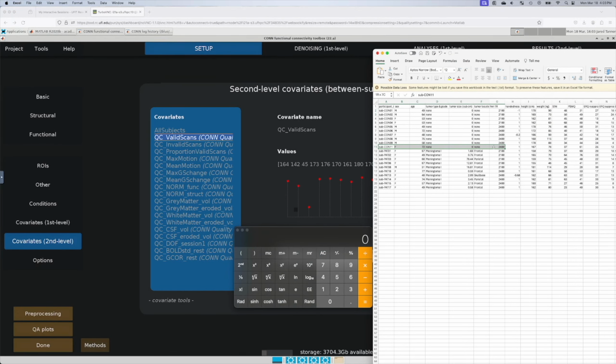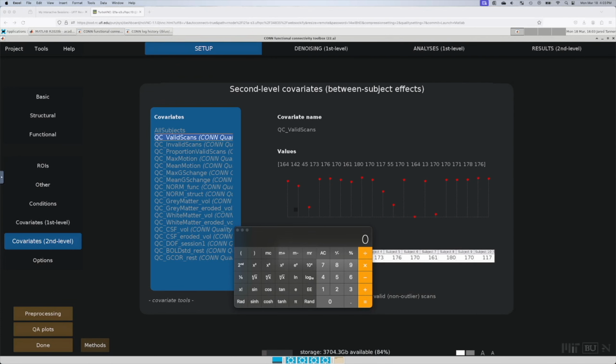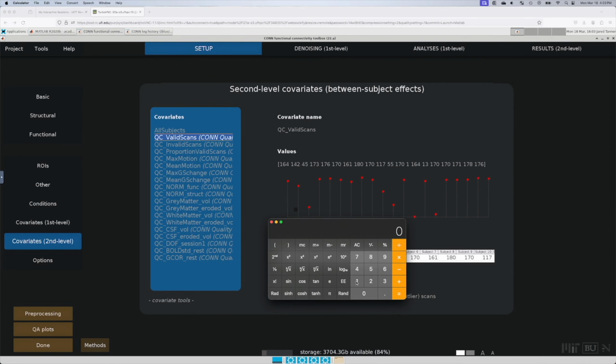So 117 times 2.4. You don't have to do all this calculation, I'm just showing this. So they had 280 seconds of scan time, which is 4.68 minutes. And so technically, this person also doesn't quite meet a cutoff. About 5 minutes is what we would want left.